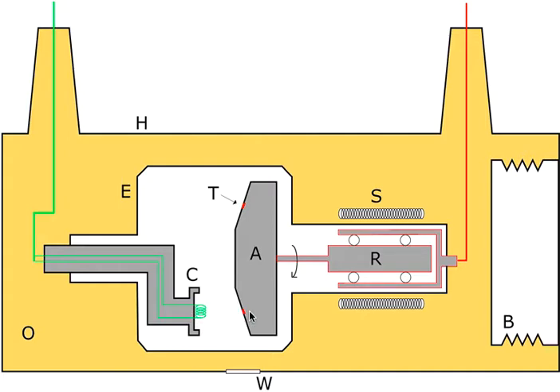They acquire speeds about one-third the speed of light, and once they're here, this is where the X-ray generation occurs. Just have in mind that there's a transition between electrons that are subsequently creating photons. So our energy and particles are changing during this process.